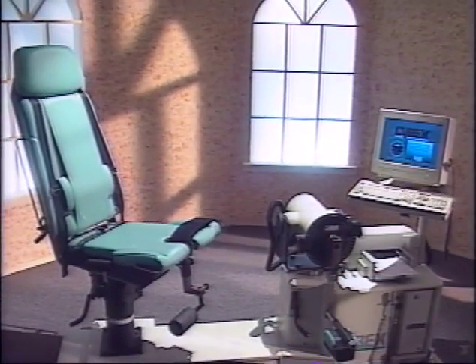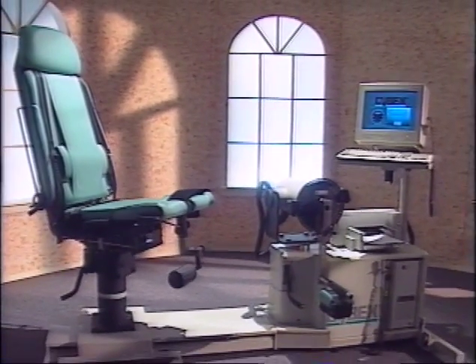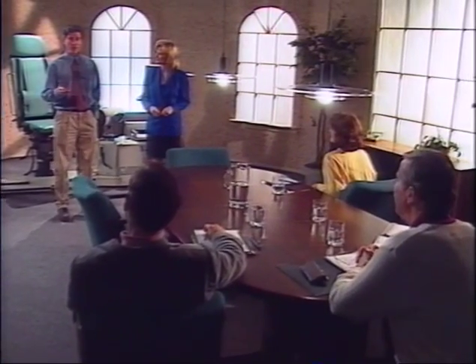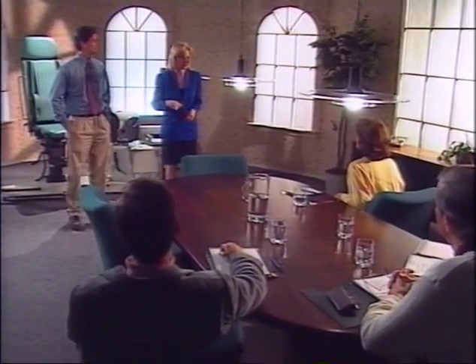I'd like you all to meet Norm, the new isokinetic testing and rehabilitation system from CYBEX. NORM stands for Normative Outcomes for Rehabilitation Management. Normative outcomes, because for the first time, you'll be able to access an isokinetic normative database of over 30,000 healthy individuals and instantly compare your patient's test results. NORM produces objective documentation based on this comparison, which you can send to physicians and insurance companies. Why don't you come up for a closer look?